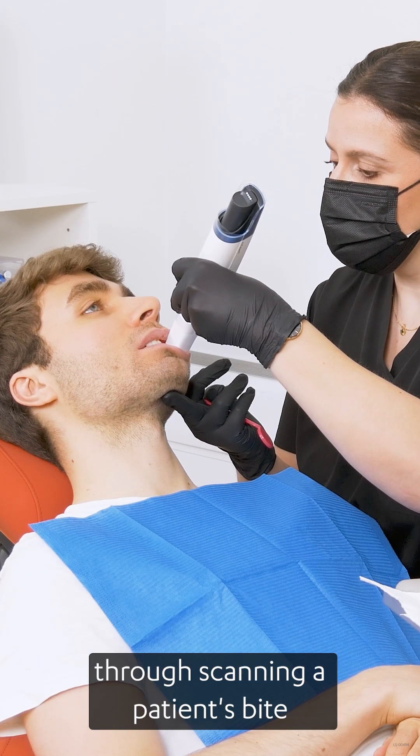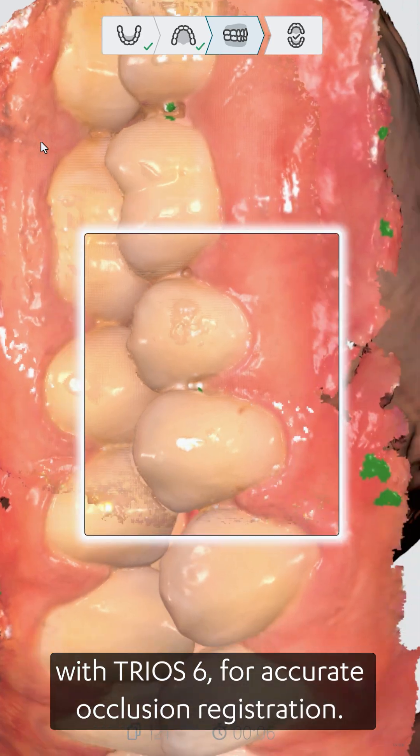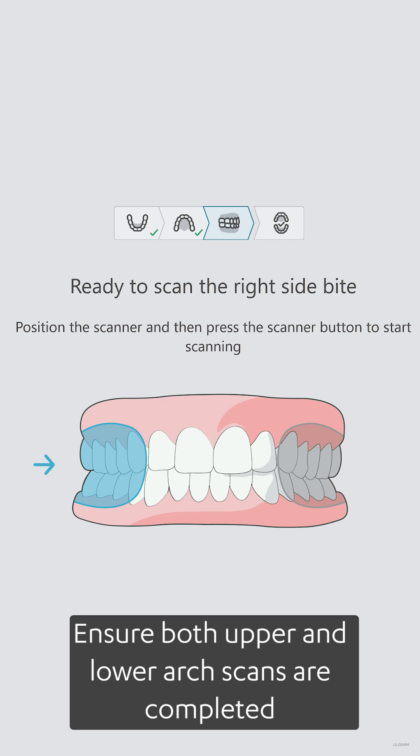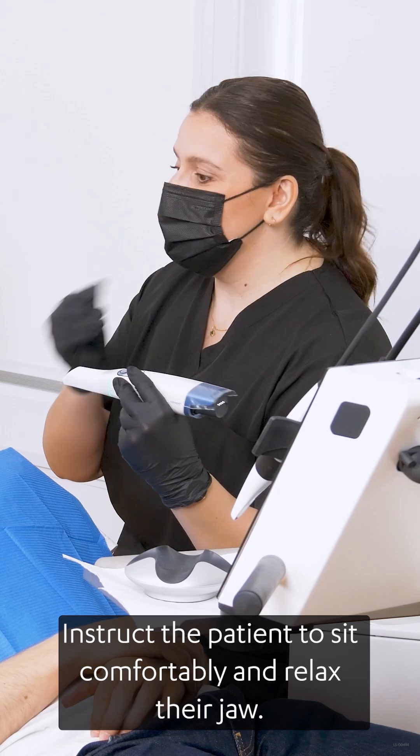In this video, we will guide you through scanning a patient's bite with TRIOS 6 for accurate occlusion registration. Ensure both upper and lower arch scans are completed before scanning the bite. Instruct the patient to sit comfortably and relax their jaw.